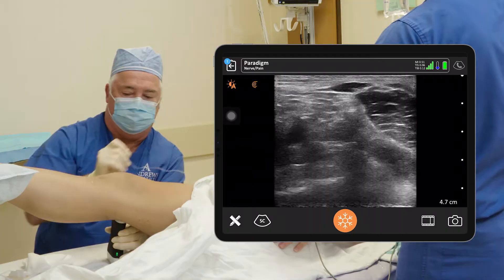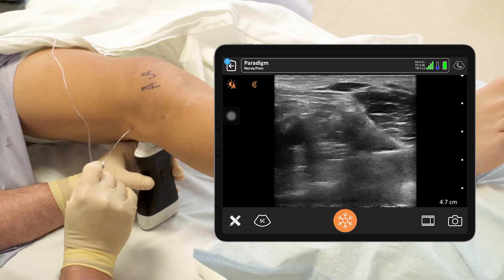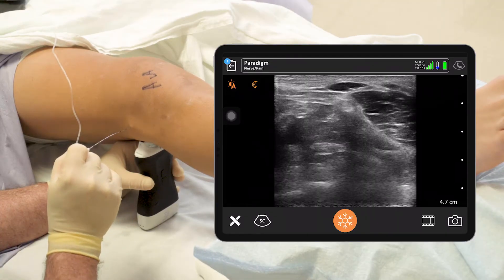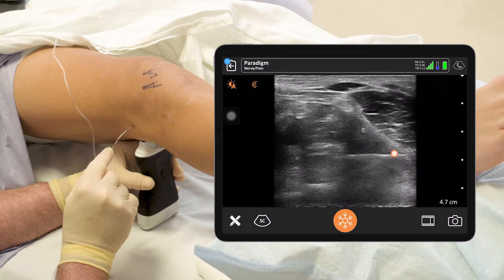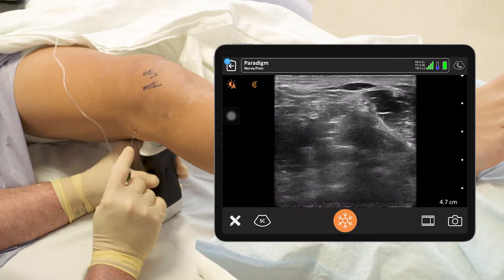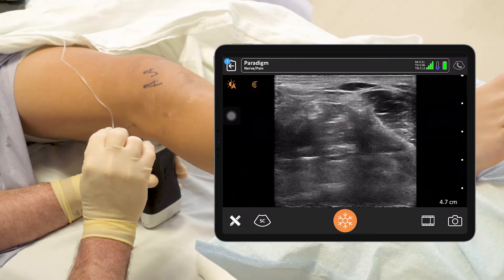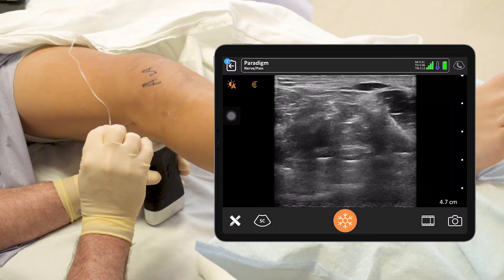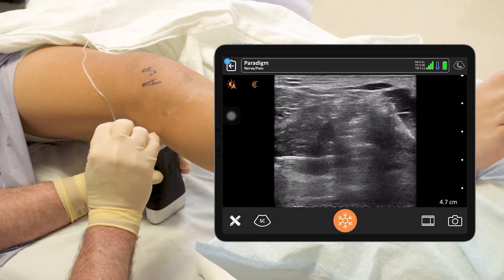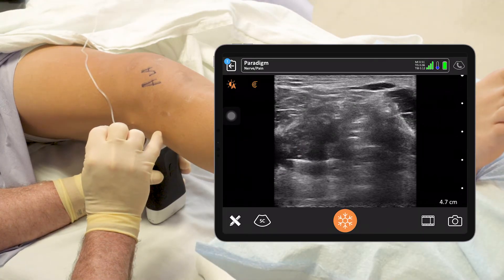Here we go. Here's our needle coming across the screen. Get down a little closer to the bone, to the femur here. I'm hitting it — get over it. Now I'll try to go down. Rocky, give me five right there. I'm going to infiltrate — one, two, three, four. We're medial to the popliteal artery, and I'm going to come back closer to under the popliteal artery.